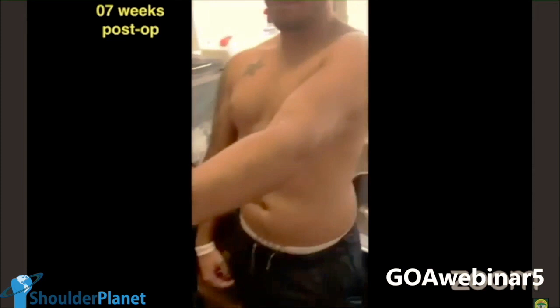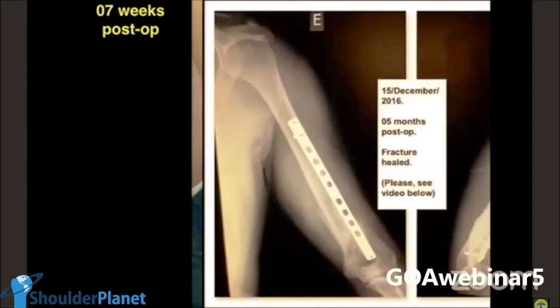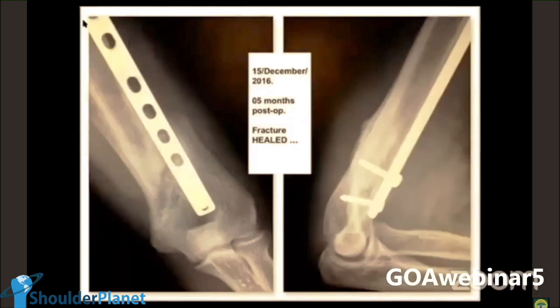And then you come to me and you say, Sergio, but what about bone healing? The answer is you just have to wait. See this, 3 months after that, lovely callus, because radiographical healing comes much after the clinical healing. Okay, so this is the final callus. I discharged this guy that day, December 2016, but how is this guy clinically at that moment?